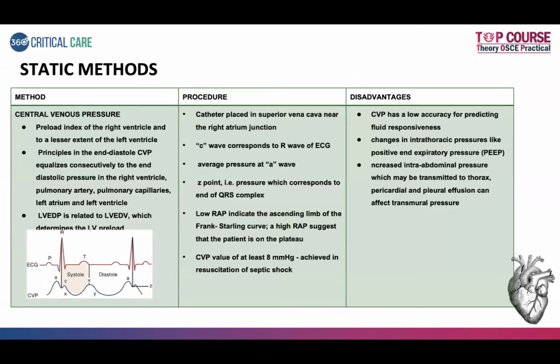But when we think about static parameters, we usually assume many things, rather than a reality. I will tell you, when we come to PAOP, we assume that the valves are normal, we assume that the pressure will be equal to volume. We assume that one chamber's pressure is a reflection of all the other chambers. So many assumptions usually come when we think about static parameters.